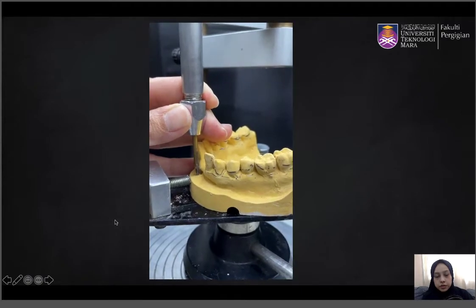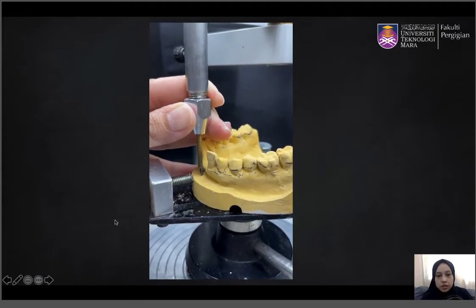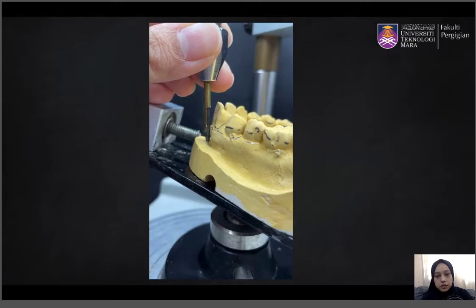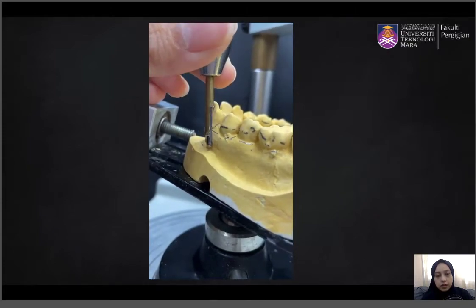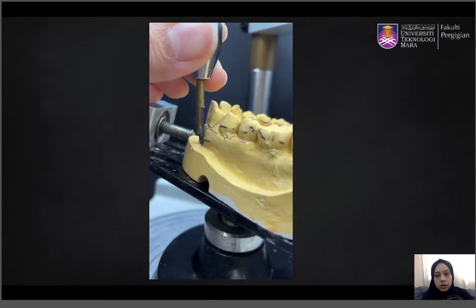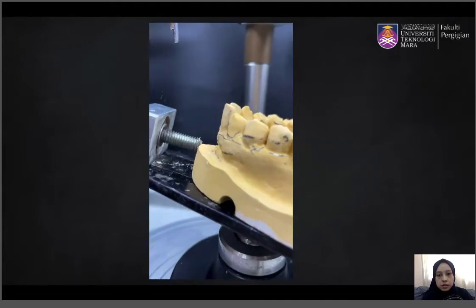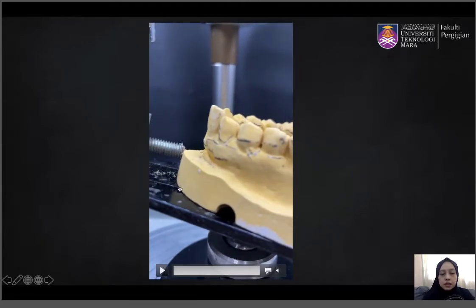Next, you want to survey the soft tissue area. It is also important to survey the soft tissue area, especially where you have the saddle — the areas where teeth are absent. These are the areas where you will extend your flange.